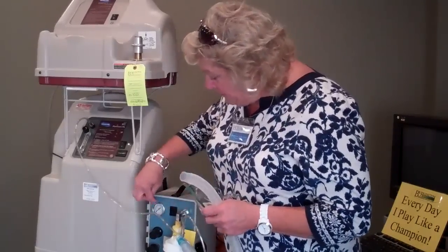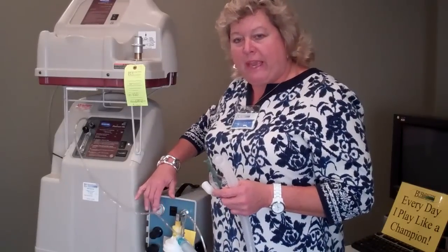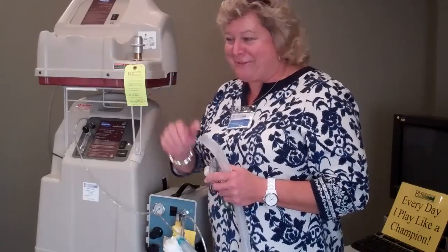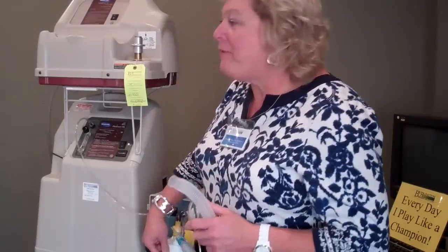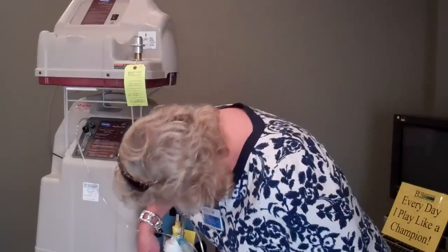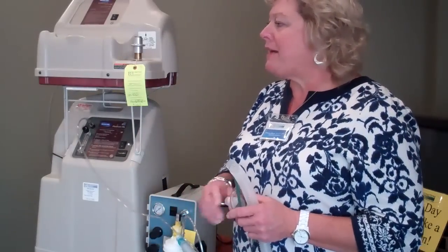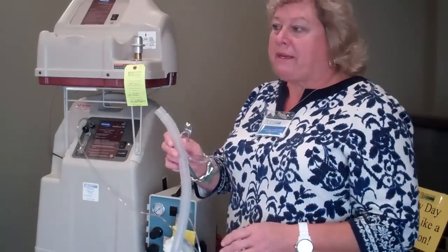Sometimes it could be that the 50 PSI gauge got moved. It could be that the jar's not screwed on good, or the little white stick is not shoved up far enough. Or they don't have water in the bottle, or it's below the minimum — because there's a line that says minimum and maximum on these nebulizer jars. But we do want to see the mist.